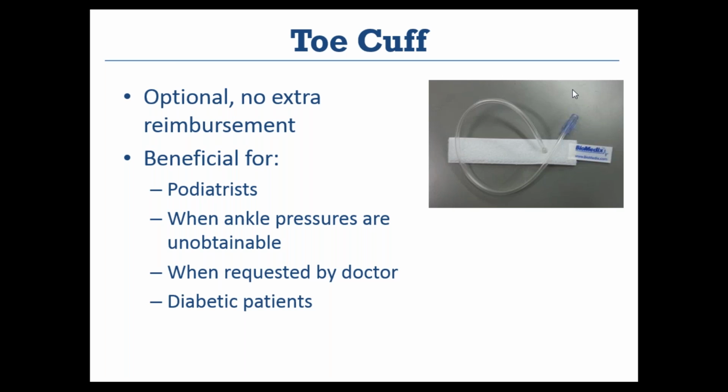If the patient has loose socks, you can just leave those on until you get to the point of the study where you do need to place things on the patient's feet. Or some offices keep a towel handy or a light blanket just to keep the toes out of the chilly air while you perform the rest of the study.